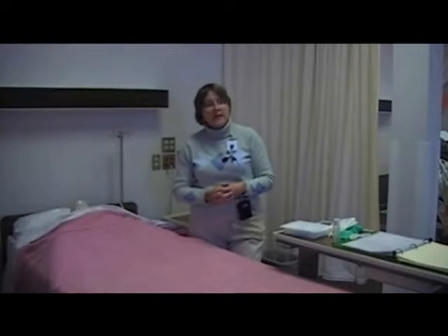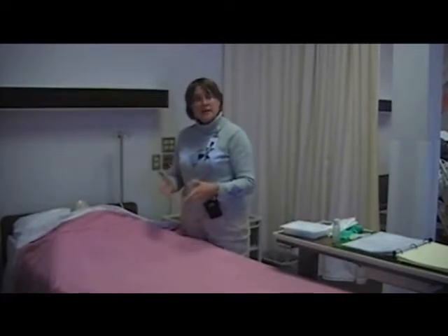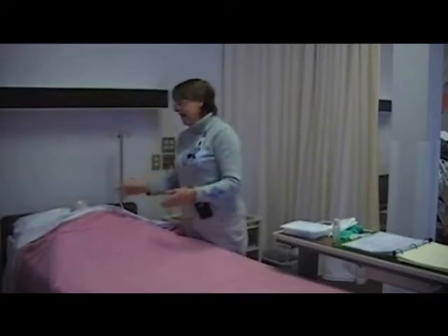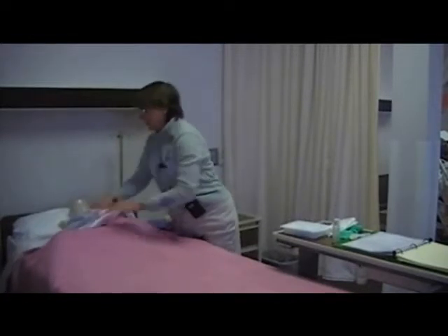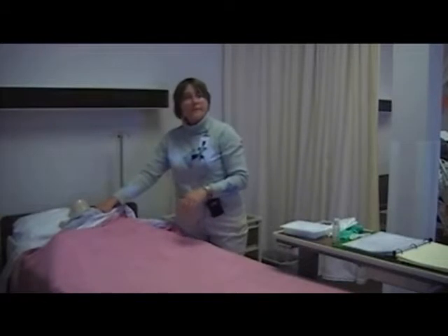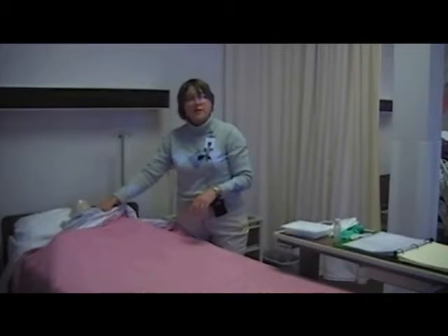So I know that my patient is due to have a dressing change today. Now, for something like a central line dressing change, it's not too common that you're going to have the doctor actually write it, because this also goes to policy. The frequency with which you change it and what you use to change it depends on policy. So when I first did my assessment this morning on my patient, I assessed him well, I looked at his central line site, and I noticed that it was changed a week ago. Now, knowing my policy, which tells me I need to do these dressing changes every 7 days, I know today's the day that he's due to be changed.